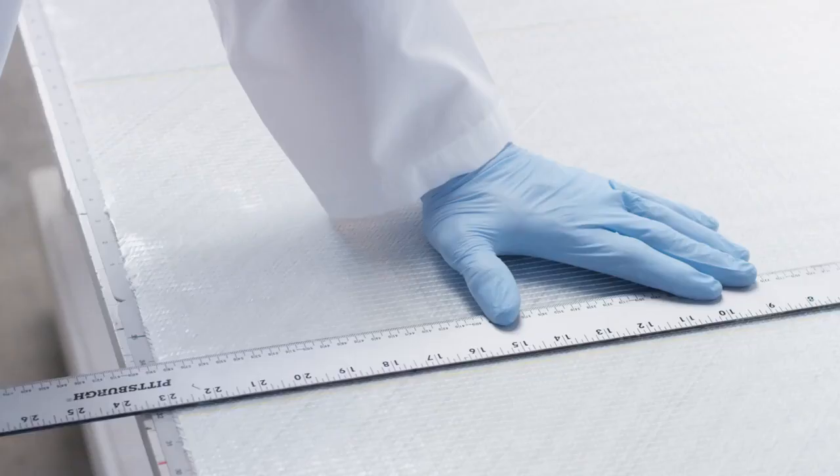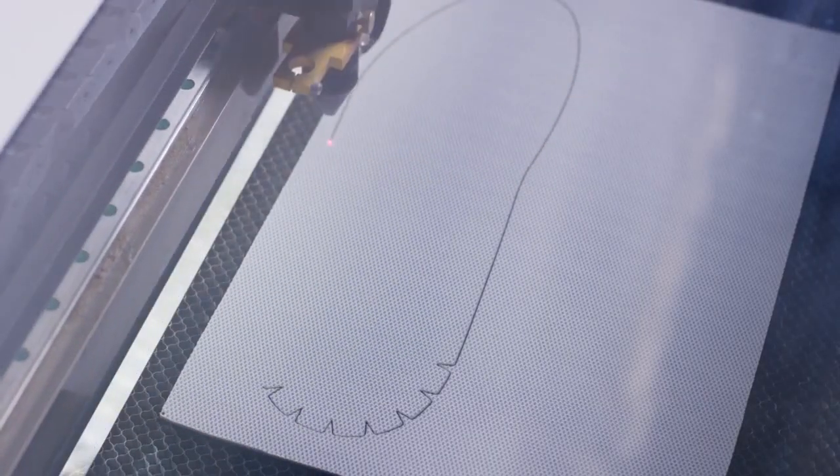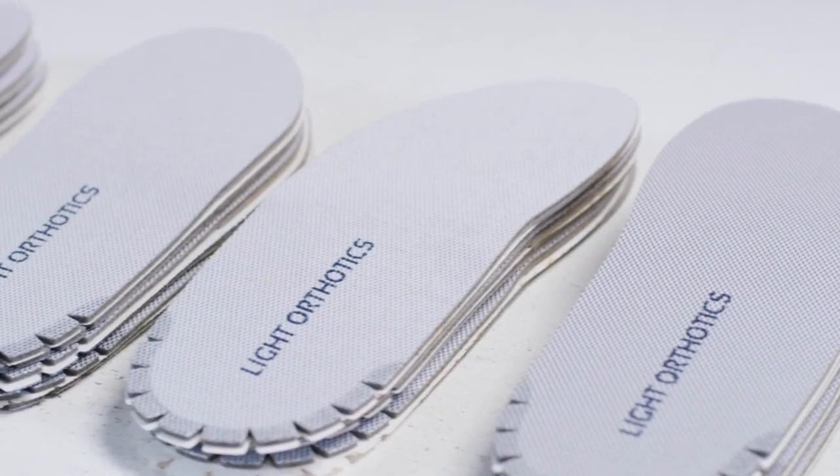Light Orthotics has developed a process to take advanced composite UV cured materials and combine them with advanced fiber designs to allow the professional, for the first time, to shape and mold a thin lightweight custom shaped device directly on the foot.